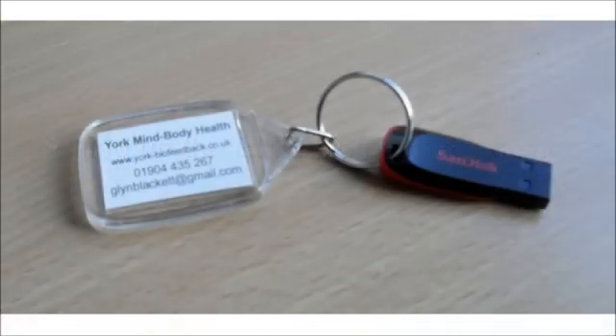A USB dongle looking something like this serves as a software license key. It looks like a memory stick and indeed that's what it is — it holds the software that you'll need to install, but besides that you'll need to connect it every time you run the software. It's worth quite a bit, so please don't forget to send it back at the end of your rental along with the device and its associated parts and packaging.